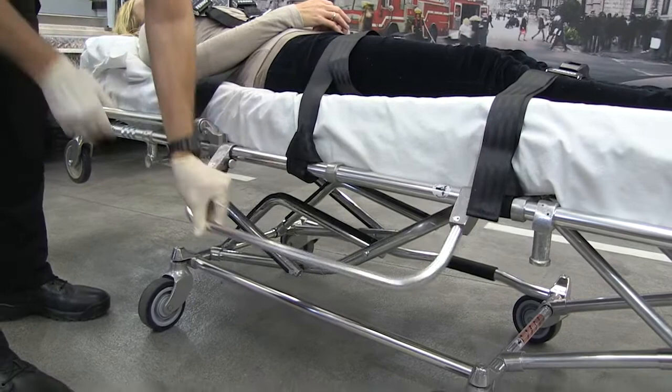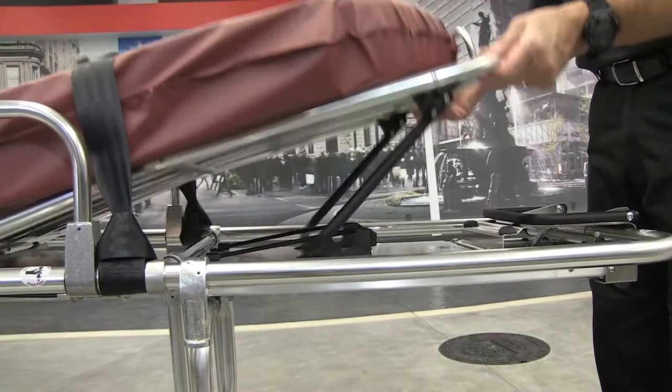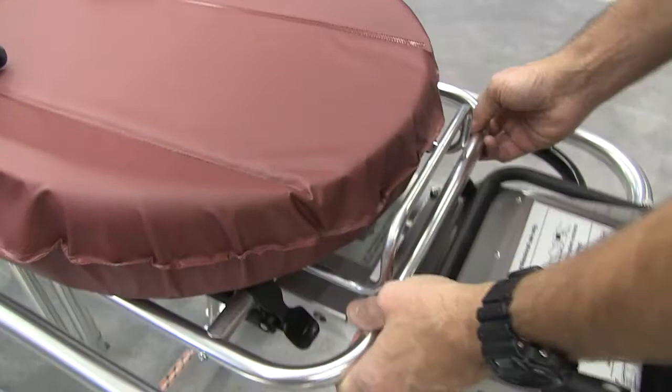When the side rails are in the lowered position, they provide easy access to the patient. When raised, the side rails provide security for the patient. The shock frame lifts up and locks into position. Lift the frame and push the buttons to lower.